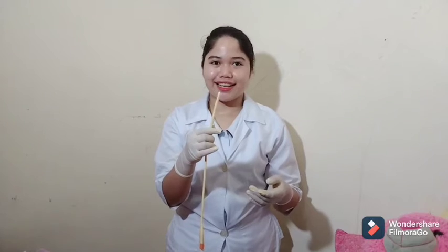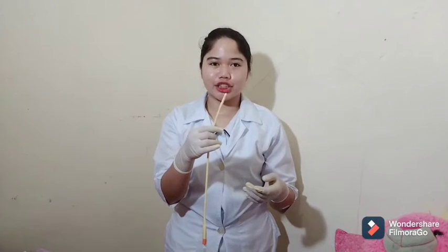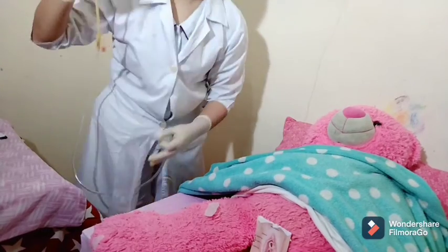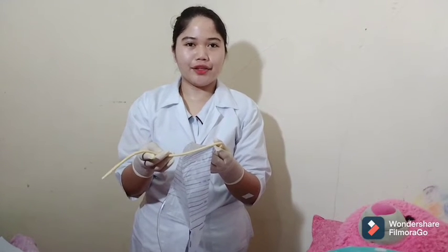Inspect the catheter to make certain it is intact. If it is not, notify the physician immediately. Measure the output in the drainage bag. Record the output on the I&O sheet. Empty the urine into the toilet bowl and dispose of the urine bag into the yellow bin.